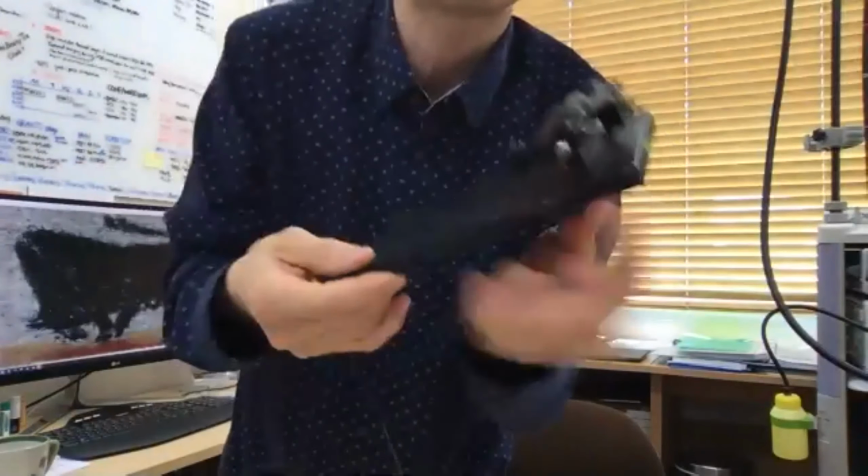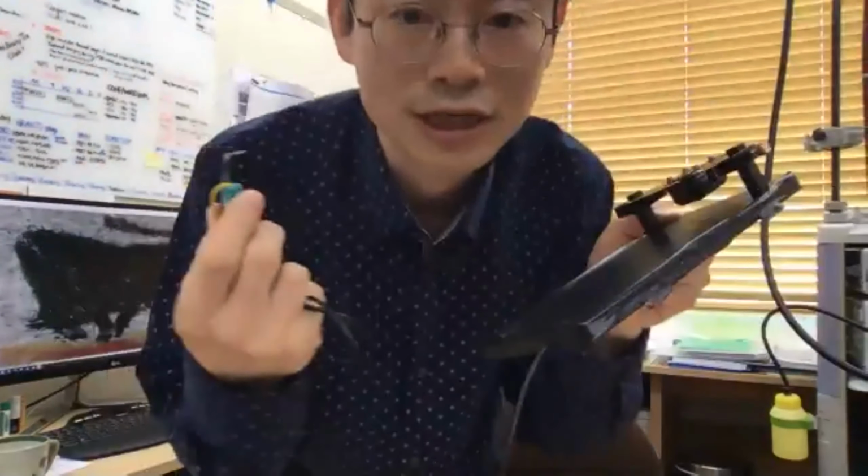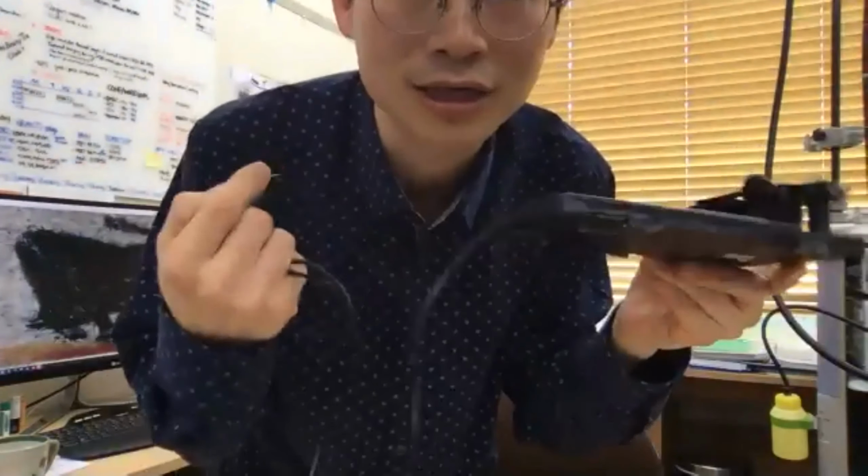Also, this plate is connected to a heating pad, so it contains a heating pad. Make sure when you are imaging that the animal is not under hypothermia.